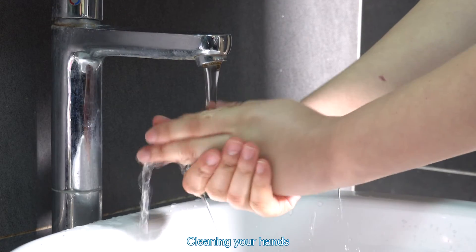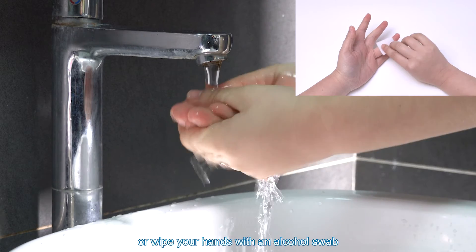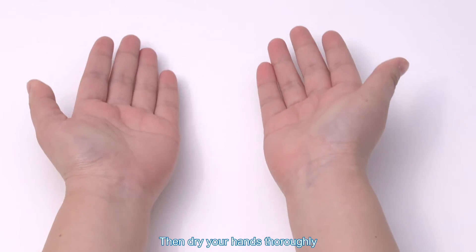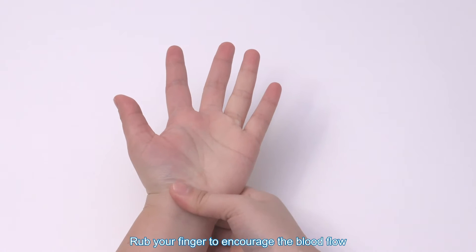Cleaning your hands. Prior to testing, wash your hands with soap or wipe your hands with an alcoholic swab. Then dry your hands thoroughly. Rub your fingers to encourage blood flow.